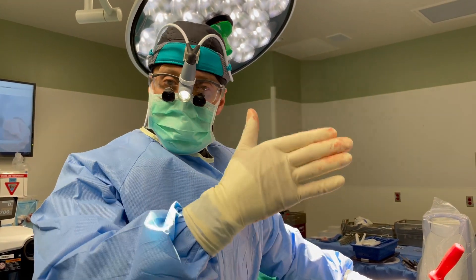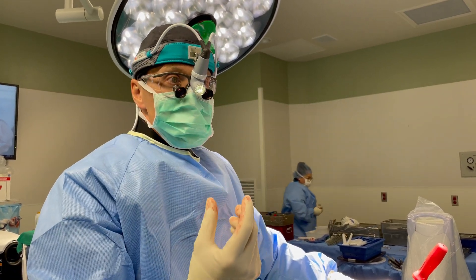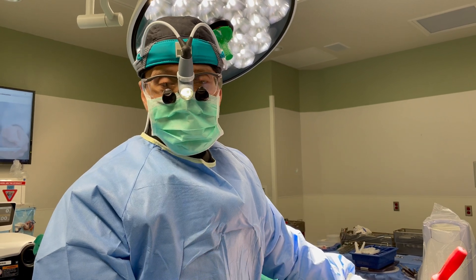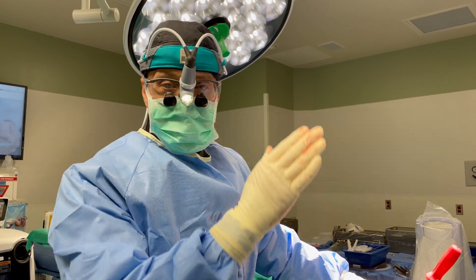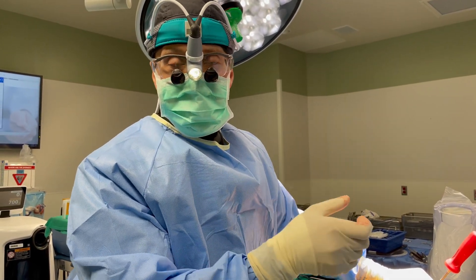We've put rods and screws on one side, and with that rod and screw construct we pulled the bone back about halfway. Now we're going to do the other side to pull it back the remainder of the way, to make it flush with the bone below so that the curve is there but the bone is not translated or shifted forward.